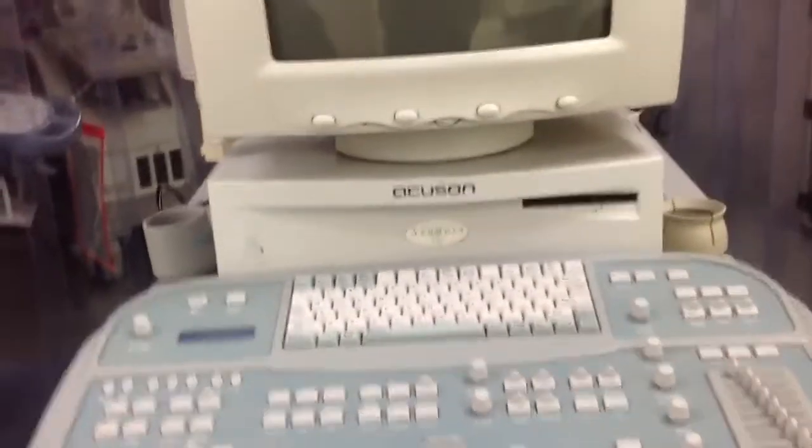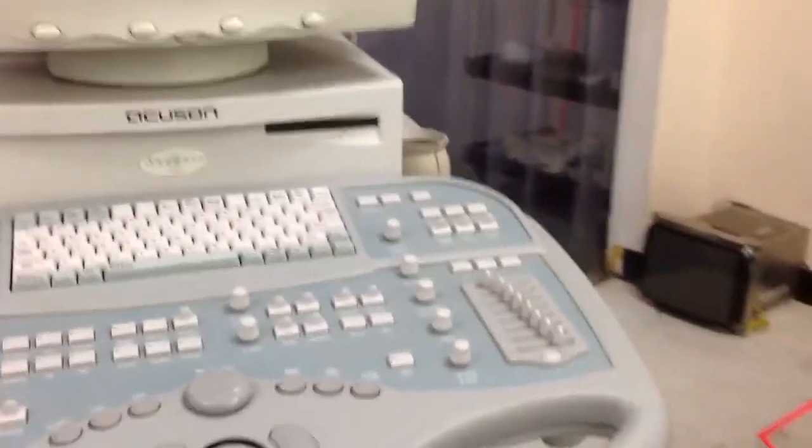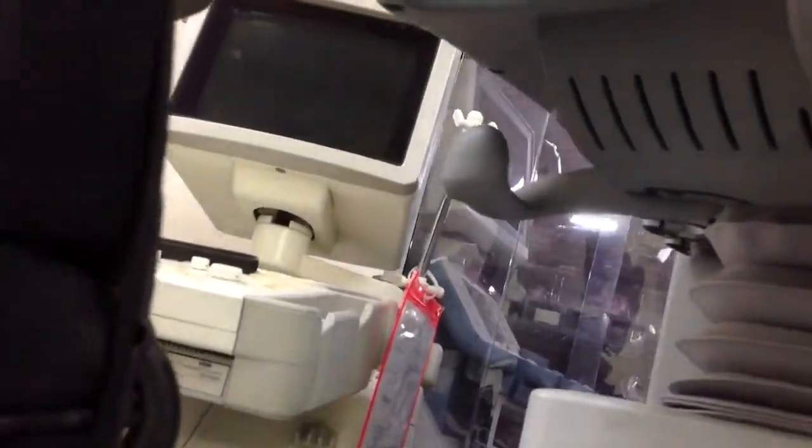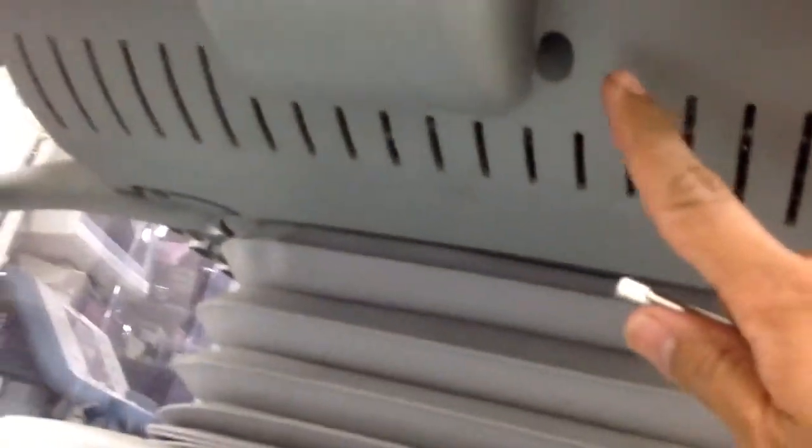First, you will need to remove the screws from the bottom of the control panel. You need to remove 11 screws all in all, starting from here. 1, 2, 3, 4, 5, 6, 7, 8, 9, and then 10 at the bottom, and 11.